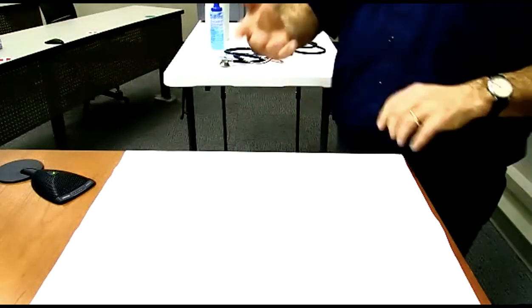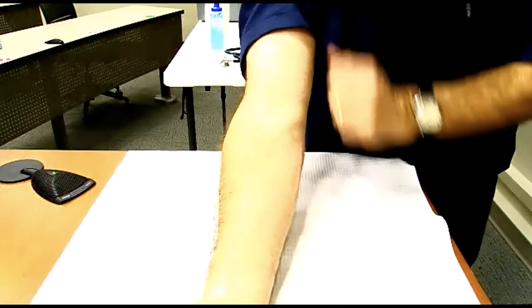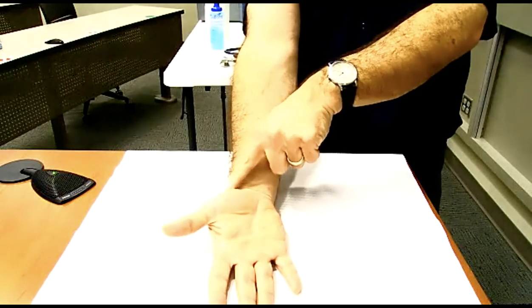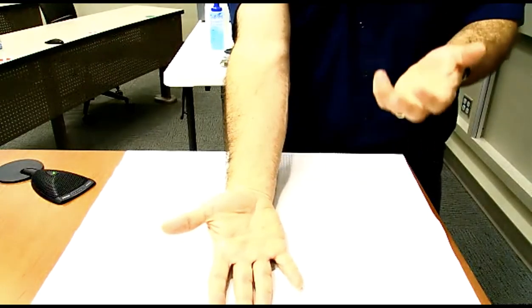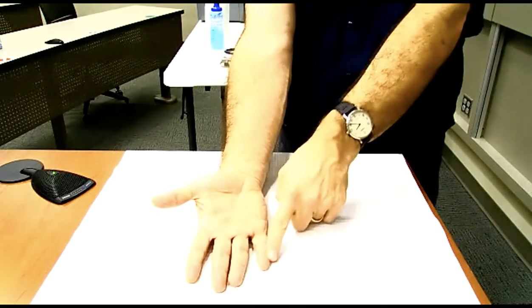Let's try, and this is going to be harder. I didn't do this yesterday, but questions got brought up about the brachial artery. So let's see if you can find it. Where is the brachial artery? We said that the radial artery is on the thumb side here. The brachial artery is where we're going to tell you to put your stethoscope. You want the stethoscope over the brachial artery. You find the brachial artery by following the pinky.